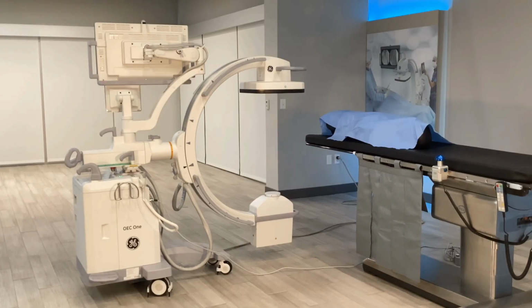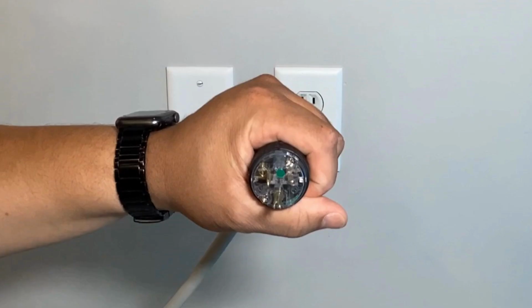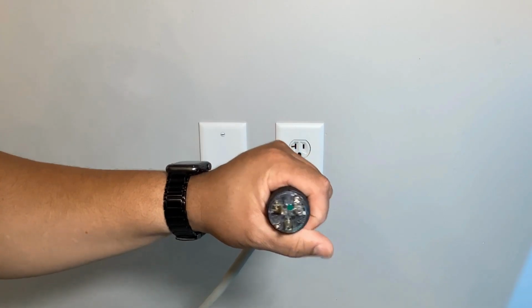This video will review general usage of the OEC1 CFD C-arm. Case support start to finish. Plug in the system. Notice it has a 20 amp plug.